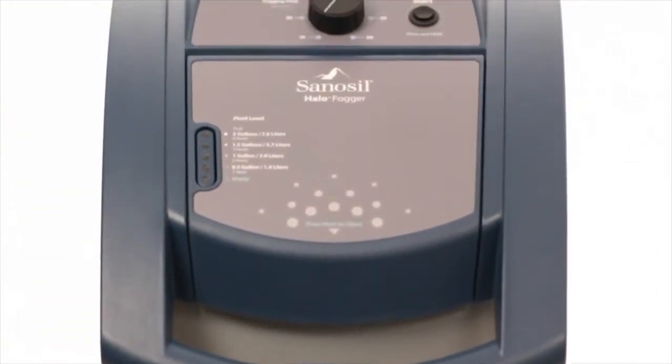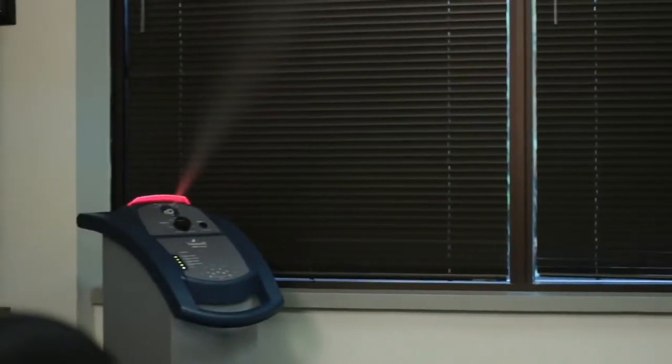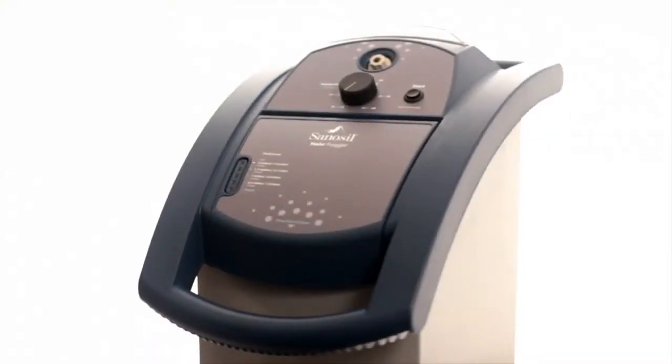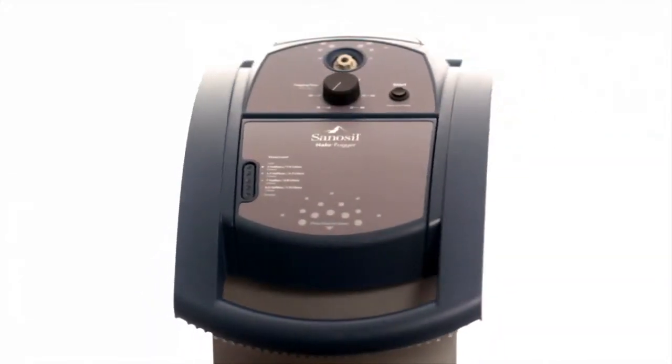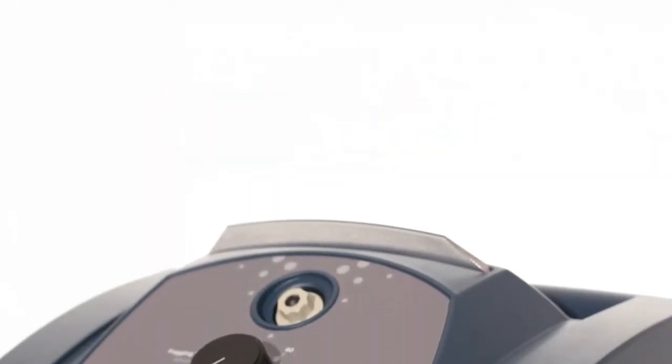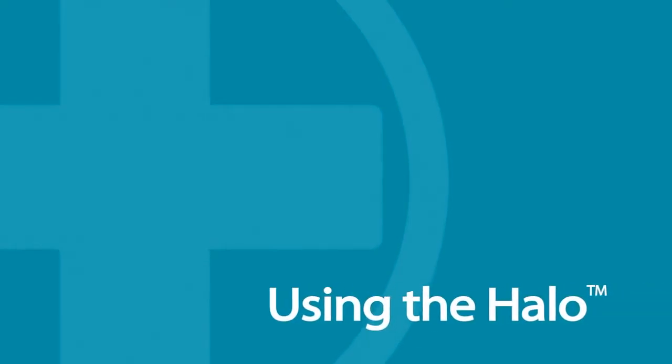With the introduction of Sanosil's Halo Fogger, adjunct disinfecting of surfaces within a room has never been easier. The Halo performs the complex task of dispensing atomized Sanosil disinfectant within large spaces and is as easy and simple to operate as your household dishwasher. Now, let's take an in-depth look at the Halo's full operation, start to finish.